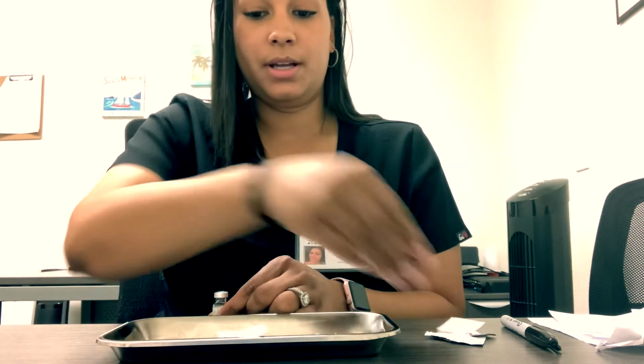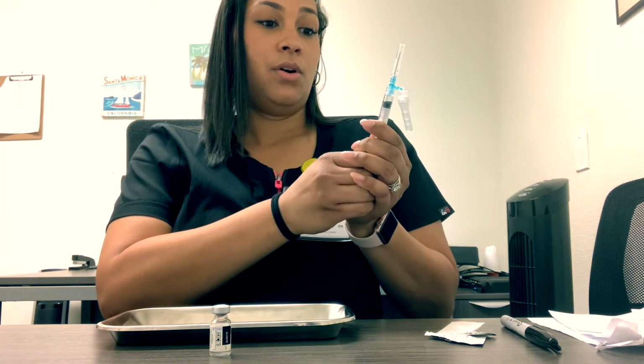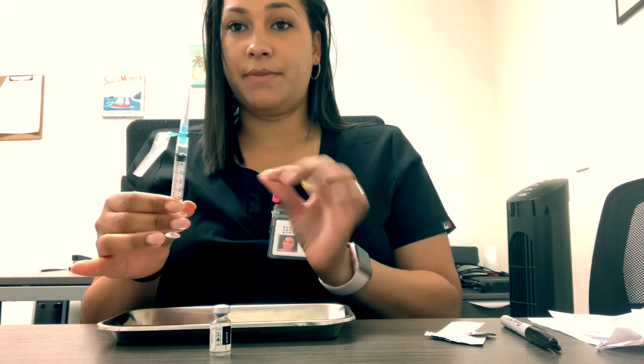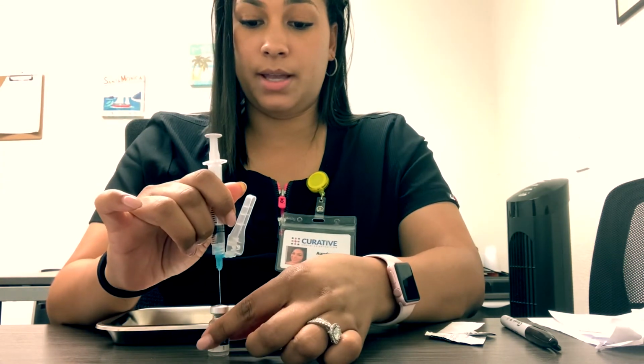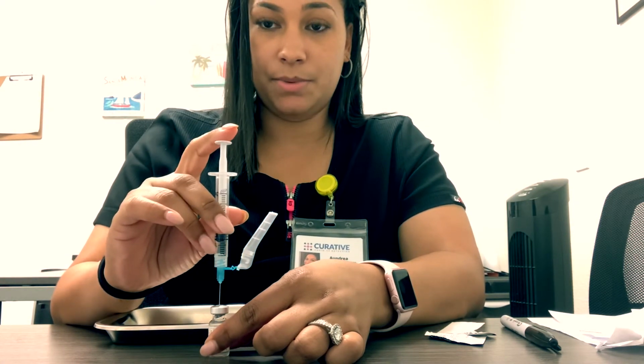After you've swirled your vial, you're going to go ahead and take an alcohol wipe and clean the top of your vial, and you're going to allow it to air dry. This vaccine doesn't have any preservatives in it. You don't want to introduce any alcohol into the vaccine itself. The dose is 0.5 mLs. So we draw back 0.5 mLs of air. Once our vial is dry, we're going to go ahead and introduce the air into the vial above the medication because we don't want to disturb it.